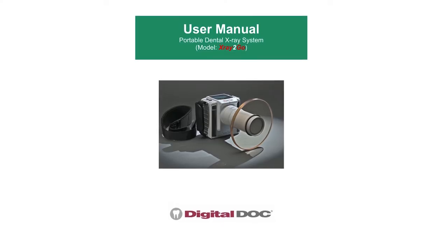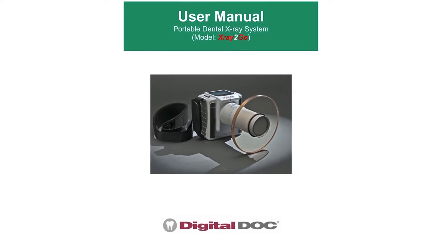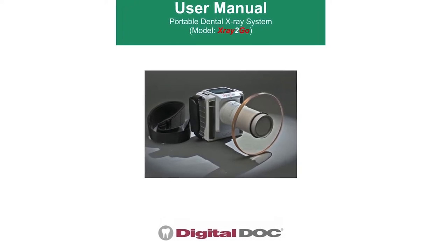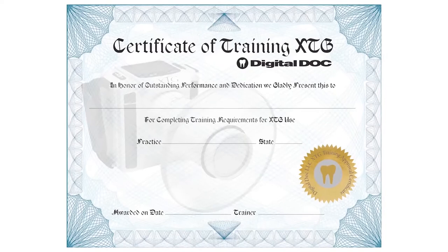As part of this training, study the manual in its entirety before operating XTG handheld X-ray. As the operator, it is your responsibility to ensure the proper and safe use of XTG. Complete any applicable exams or certificate of completion required by your jurisdiction.